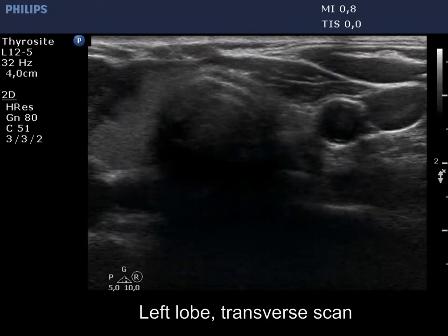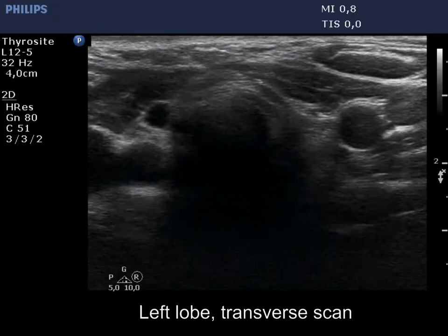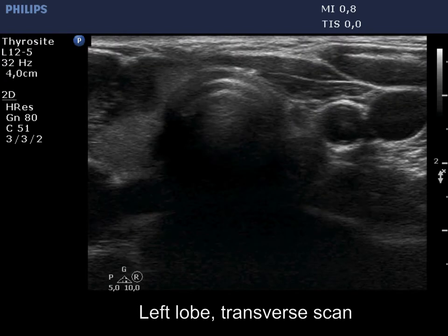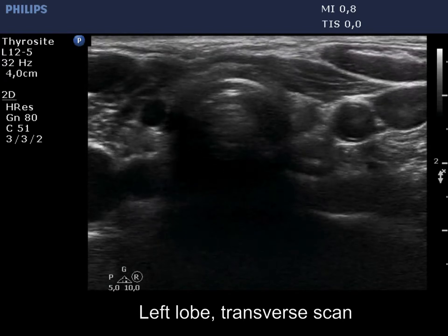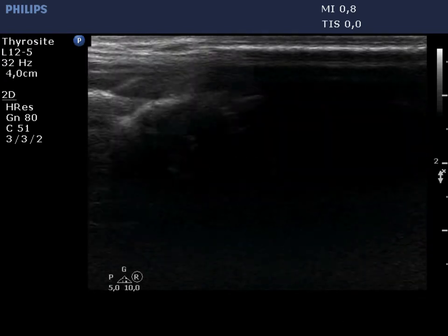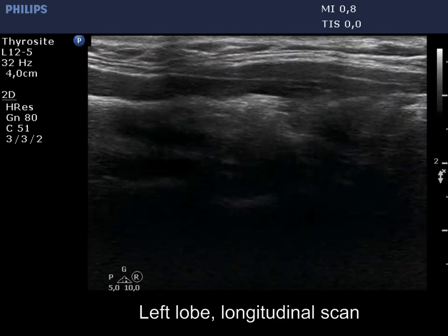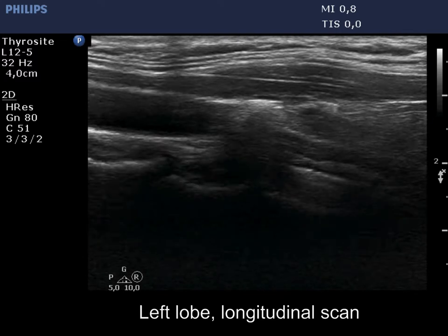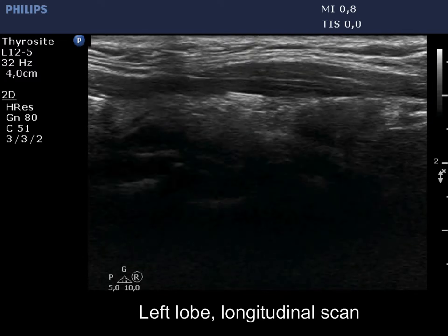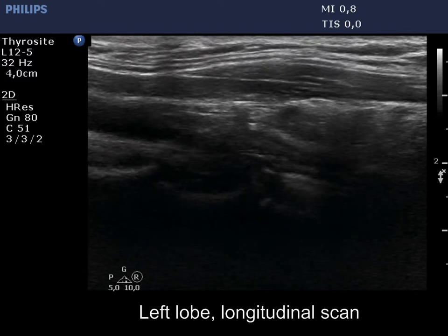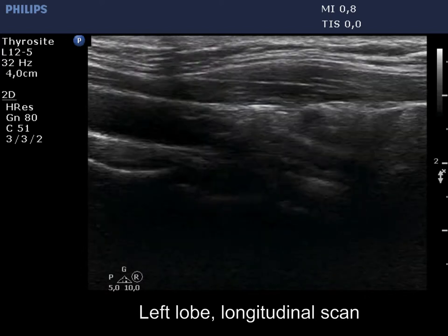The left thyroid bed is filled with connective tissue. There is a small hypoechoic, discrete lesion within. It became evident on longitudinal scan that this cannot be a muscle fiber; this corresponds to thyroid remnant.